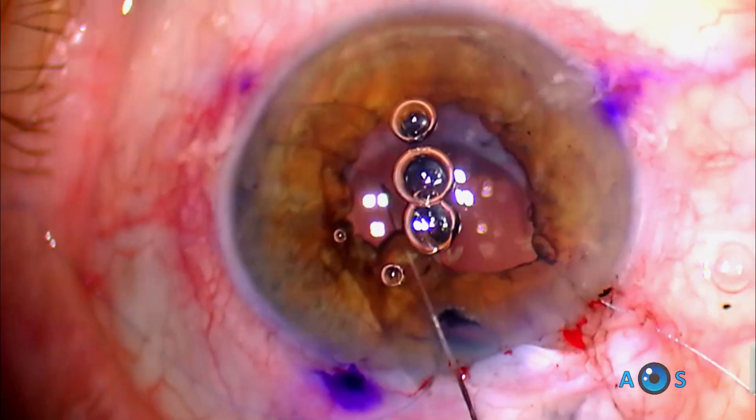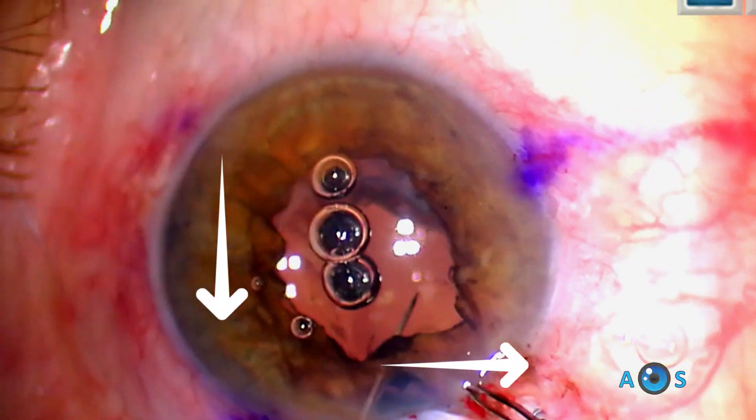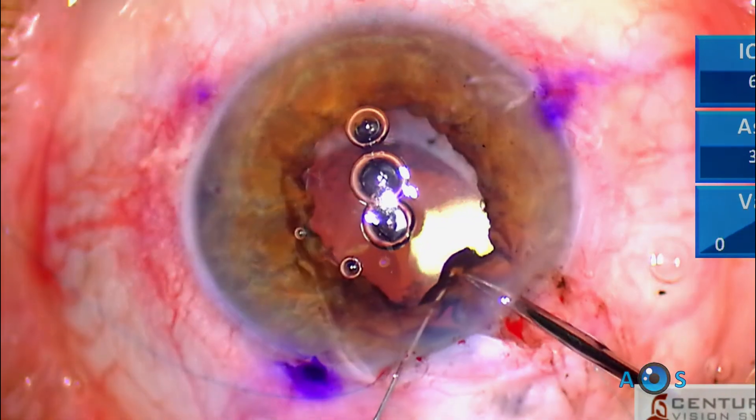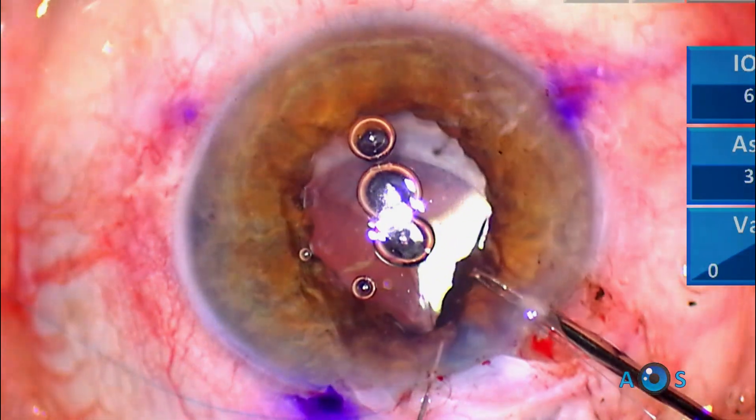Now the final and most challenging segment: the second needle enters superiorly and is directed nasally to capture the superior pupillary sphincter, exiting through the same paracentesis to meet the first suture thread, which will then be tied.